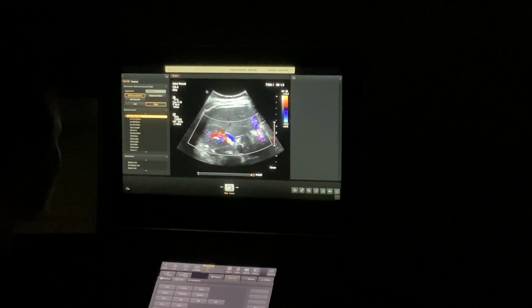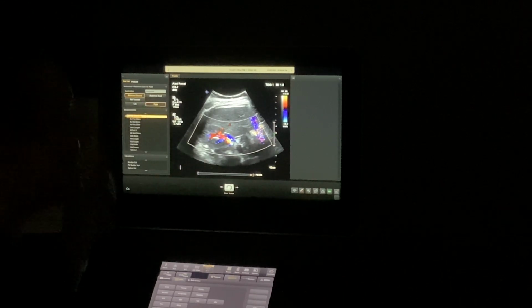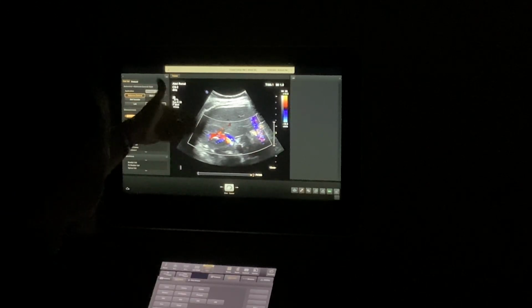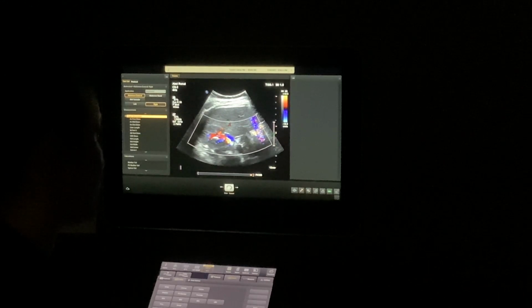Renal artery and renal vein. I got both. Here's renal artery, renal vein. And do y'all notice when I gave it that little bit of an angle, how much better that color showed up? That's what I want you guys to do. Just a little bit of an angle. Do I have a shadow here? Yes, but that's not the point of this picture. I already took the picture showing that one, right? So take me one good one showing this color when you're doing a color picture. This shows me perfusion out into the cortex here, okay?